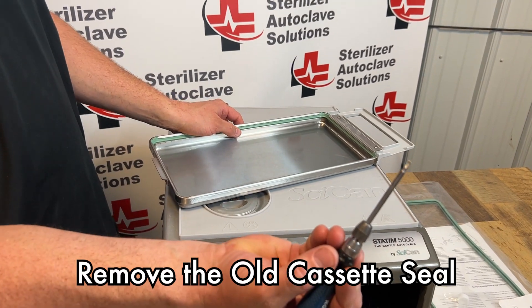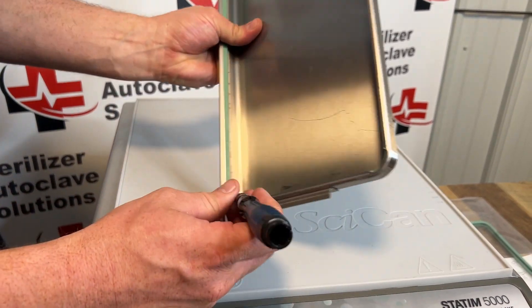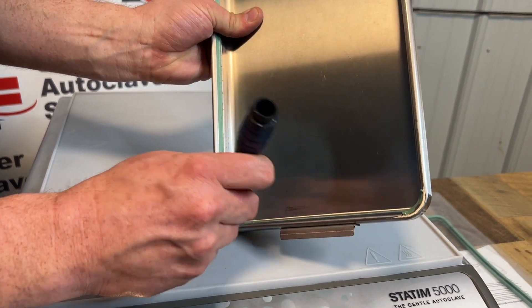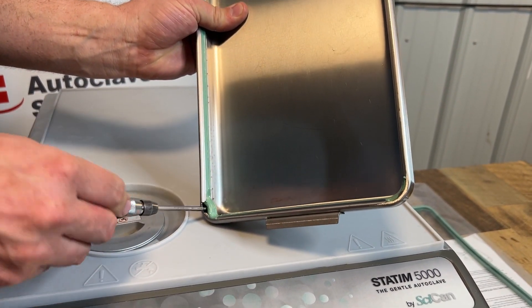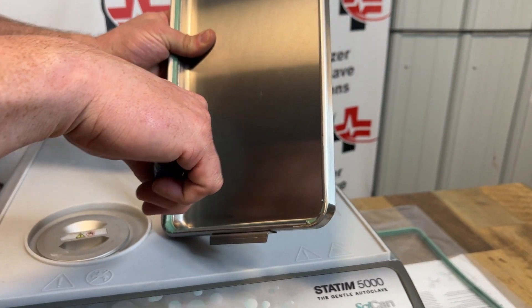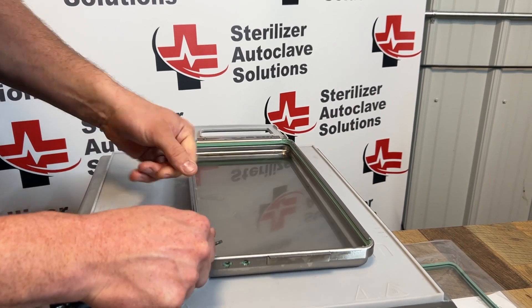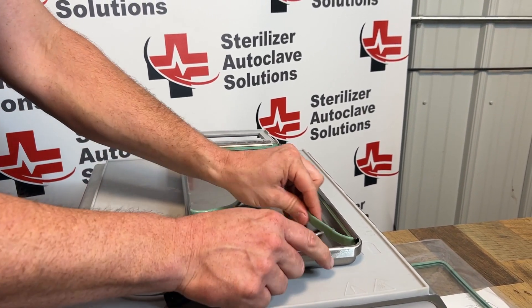Using a small flathead screwdriver I'm going to put it on the back side of the seal and gently work it out. Try not to stab the seal as you're getting it out. Once it pops out you can roll the rest of that seal all the way out.